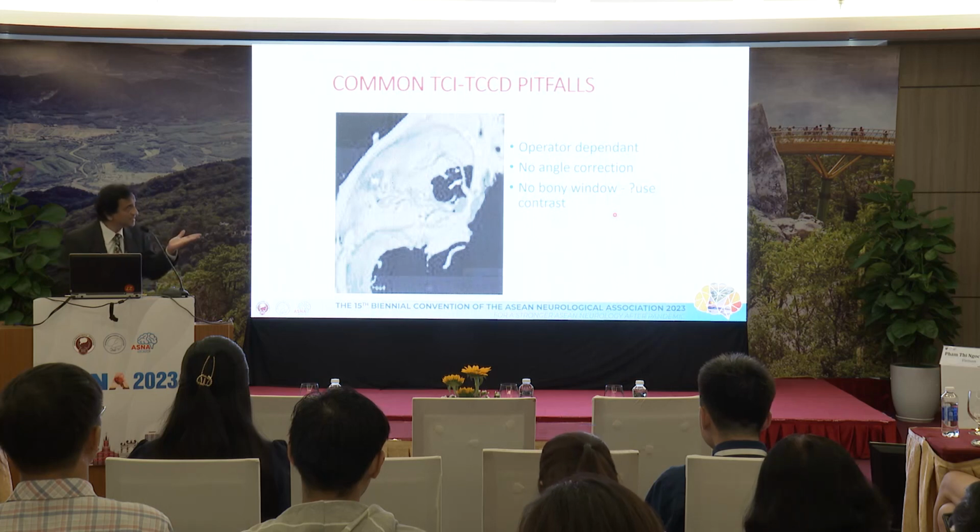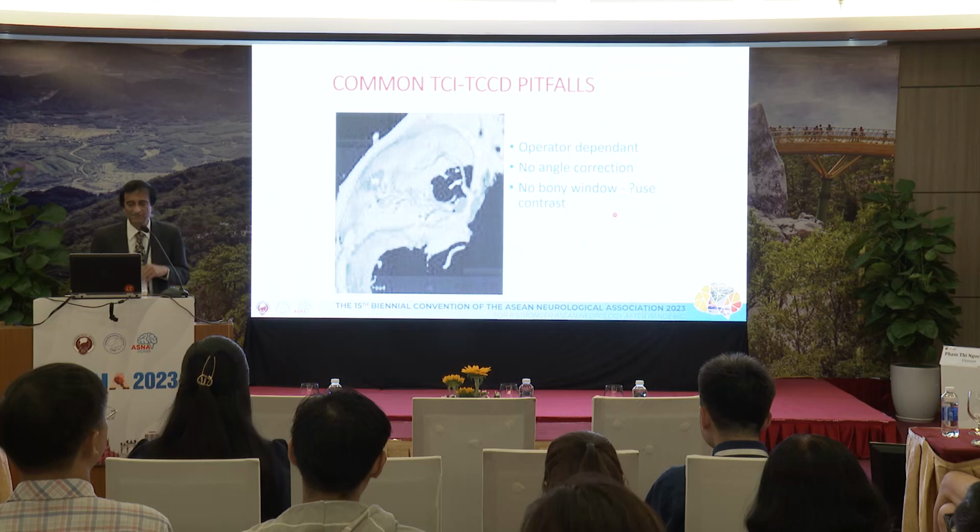It is easier than TCD. You have experts in TCD, they'll do that in 20 minutes, you're done. I'd still take a long time to do it. They're very, very good. Sometimes you can't find a bony window.